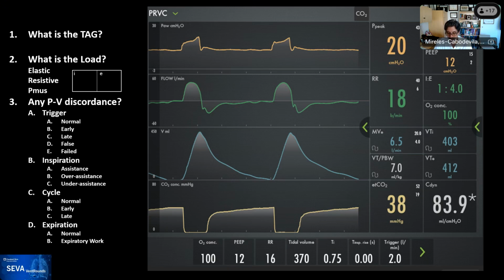There's a response. All right. And Alicia grabbing the front, and it just starts coming through. Excellent. And I mean, for this case, we're not even hiding anything, right? We're keeping all the information.